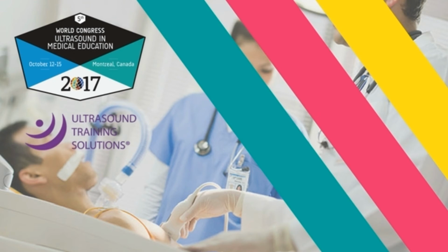That complex psychomotor skill is the hardest bit. Holding the probe in the hand and being able to get the window is the hardest part of all of it. So the videos help contribute to the learning and are not useless. They're very useful in developing pattern recognition and understanding the theoretical constructs, but it doesn't help you to get the actual picture and to successfully acquire an image that is diagnostic.